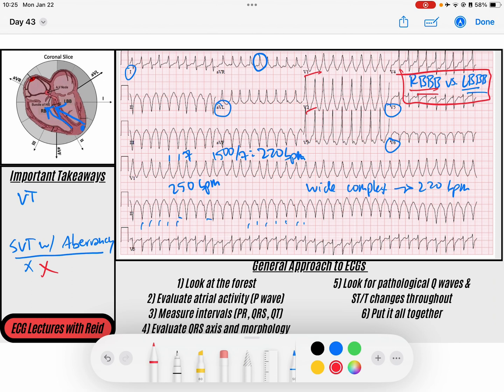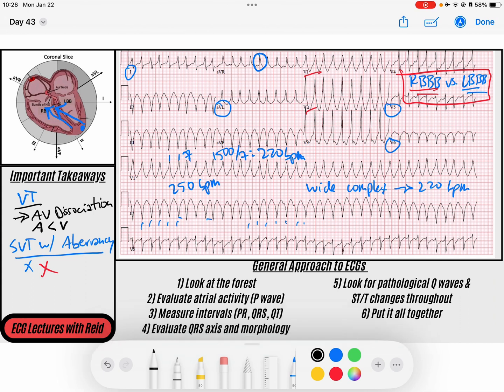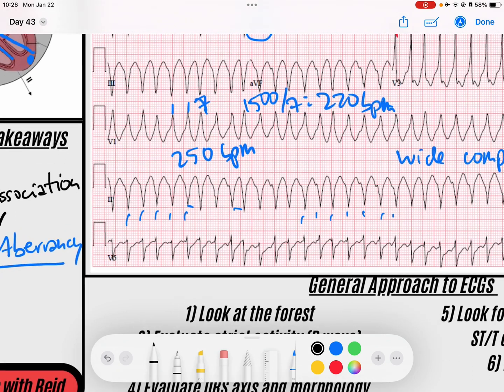The one thing that I want you to note on this EKG that's really going to help you determine that this is ventricular tachycardia is something called AV dissociation. And AV dissociation, what that means is that the atrial rate is less than the ventricular rate. So how can you figure that out? That means that we will not have a P wave for every QRS. We will have more QRSs per P waves.